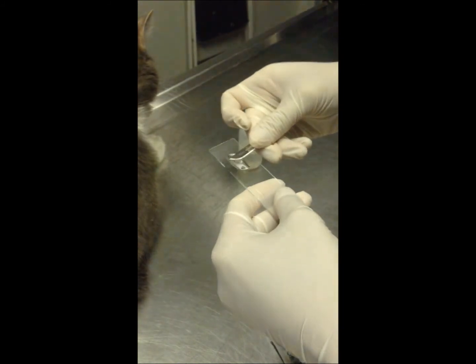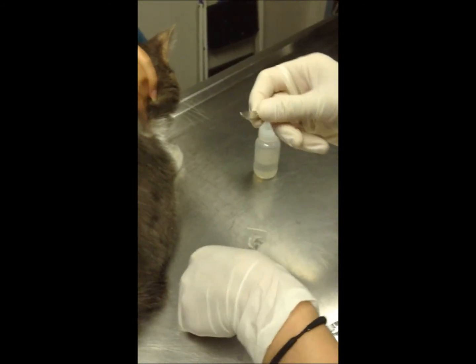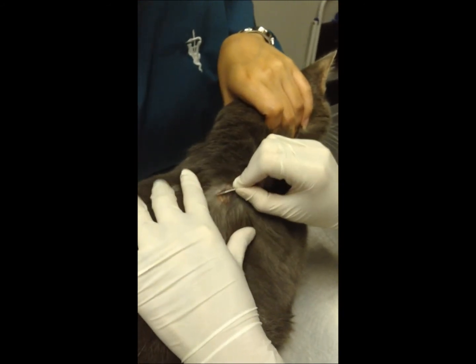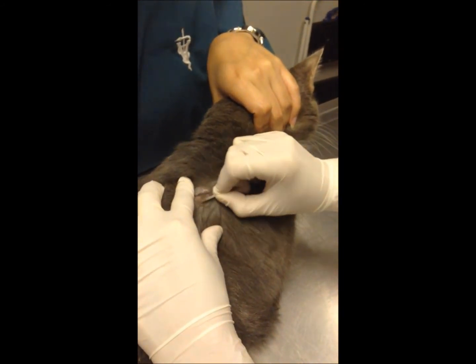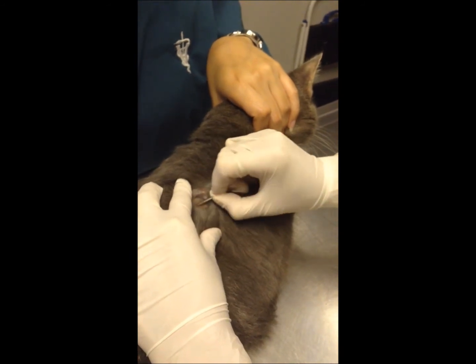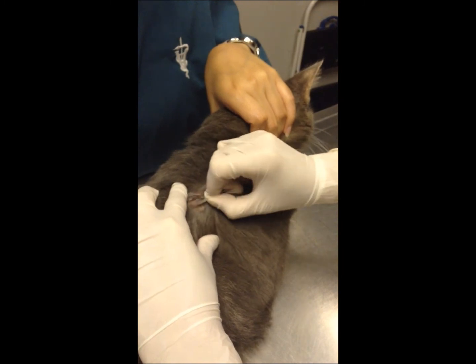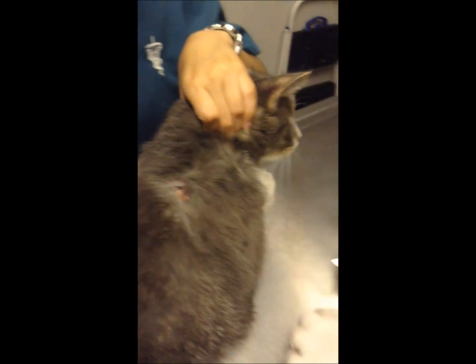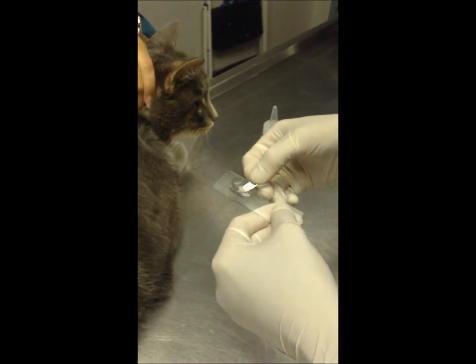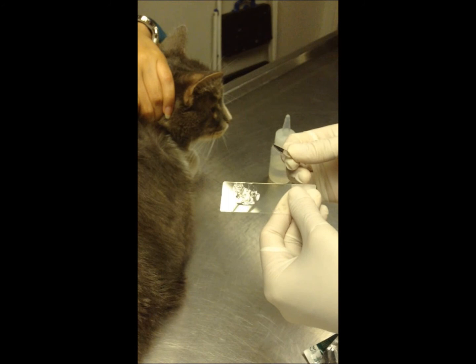We're going to stick it on the slide. We'll get a little bit more just in case. And then when you're done, you can apply some ointment to the area so that it brings down the inflammation. I'm sorry. Okay. Alright, so now we're going to bring this to the microscope and look at it under the microscope.